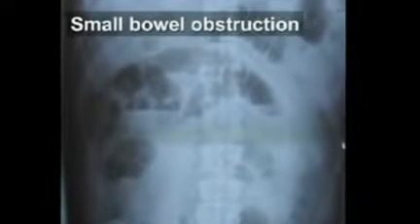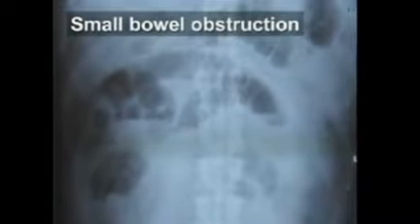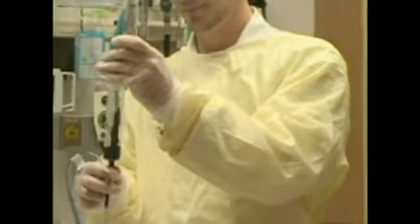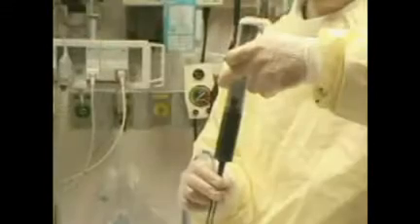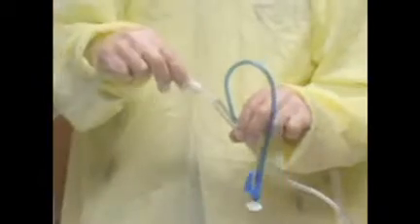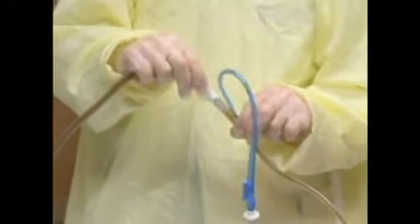Common indications for nasogastric intubation include decompression of the GI tract in patients with bowel obstruction and gastric emptying in intubated patients to prevent aspiration. NG tubes may be placed as an adjunct for the delivery of oral agents such as activated charcoal or oral radiographic contrast media. NG tubes are often placed in patients with suspected upper GI hemorrhage.